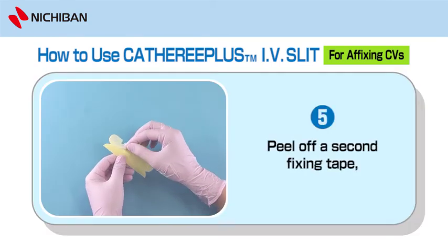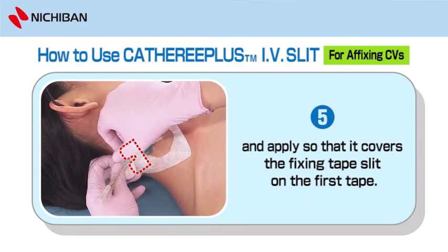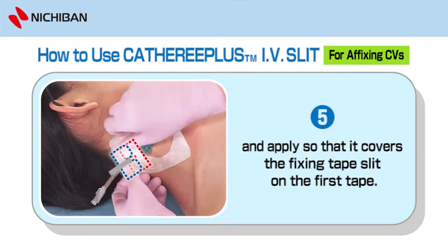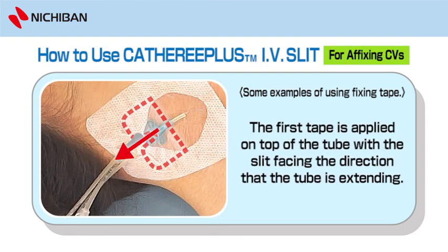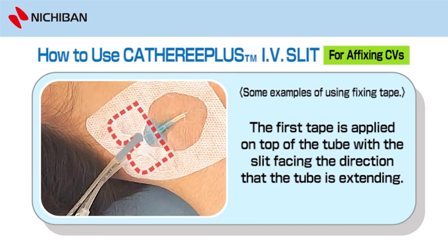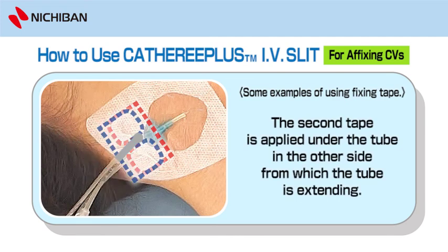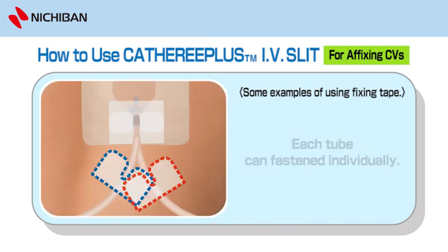Step 5: Peel off a second fixing tape and apply so that it covers the fixing tape slit on the first tape. Step 6: The first tape is applied on top of the tube with the slit facing the direction that the tube is extending. The second tape is applied under the tube on the other side from which the tube is extending. Step 7: Overlap the slits for greater stability. Step 8 and 9: Each tube can be fastened individually.